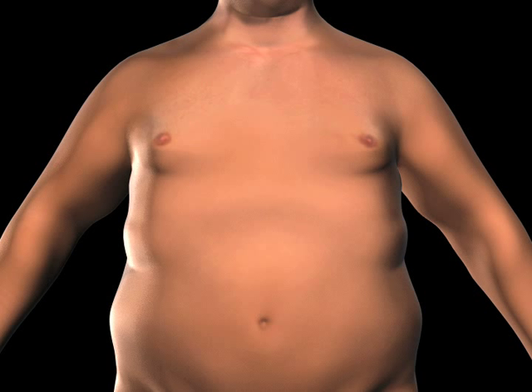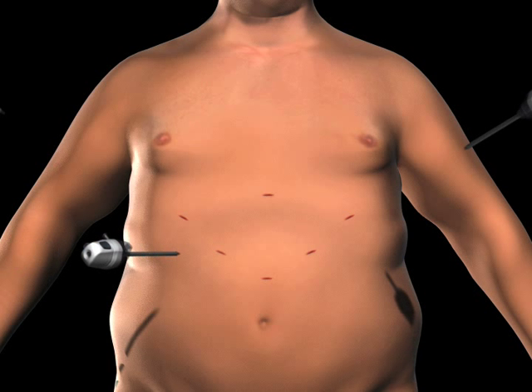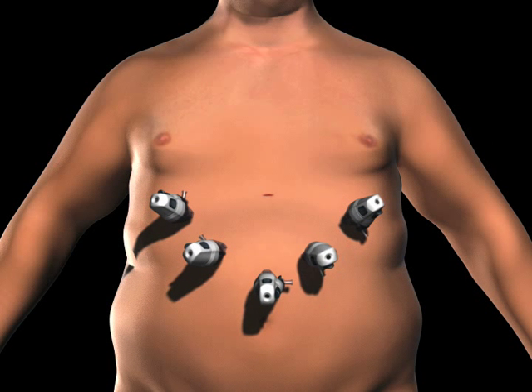To gain access to the abdominal cavity, small incisions are created on the abdomen. Trocars, which serve as passageways for surgical instruments, are placed into the incisions.